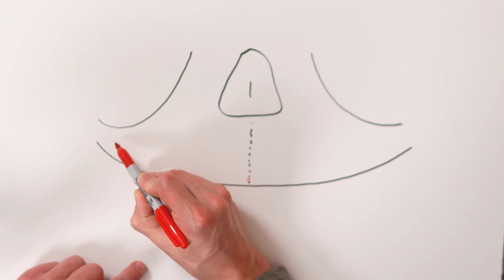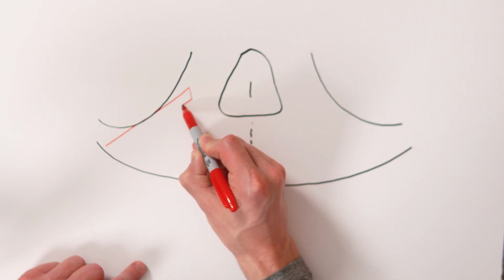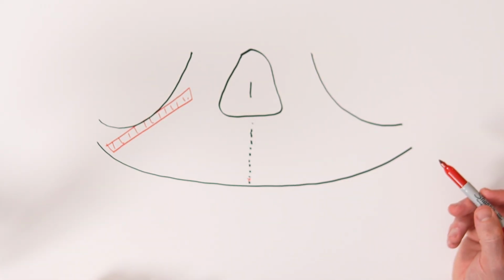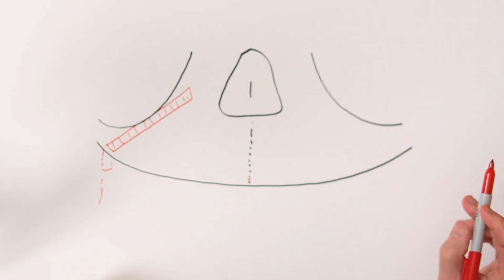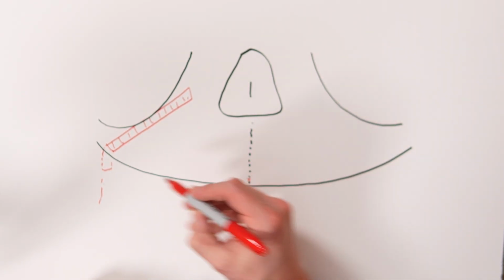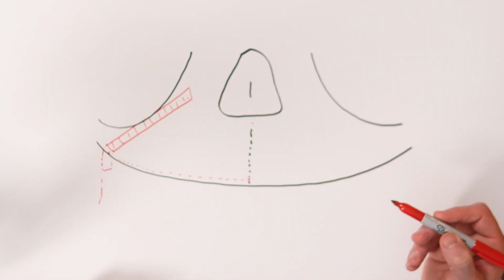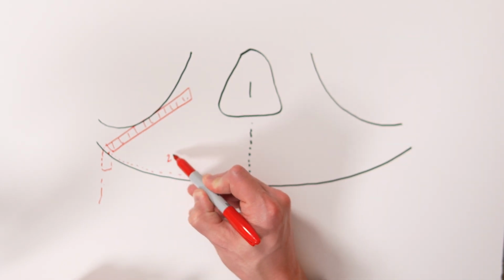Now, basically, I place the implant first. I just visually, I place, maybe my implant's going to be here, okay? So maximum AP spread along that sinus wall there, exiting, on the ridge. Here would be your abutment. So I then take the ruler on the Panorex image and I just simply measure this distance from here to here. And this is usually going to be, let's say, something like, 25 millimeters.